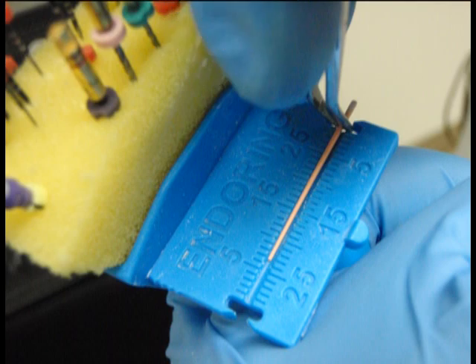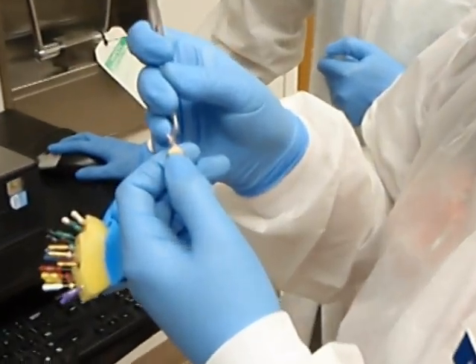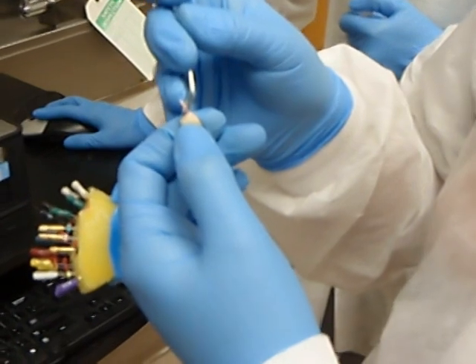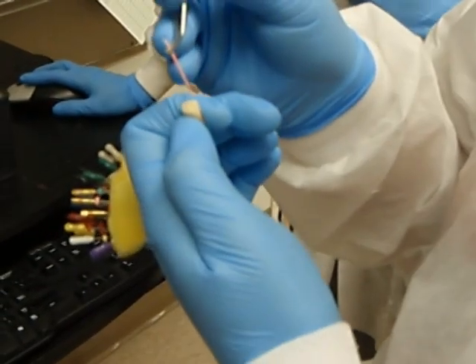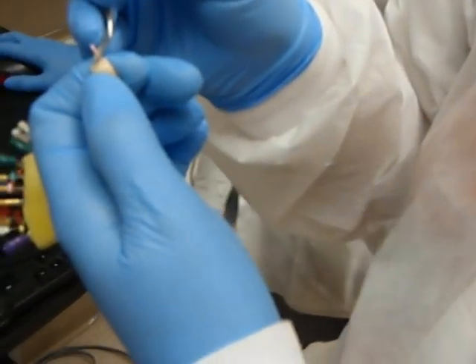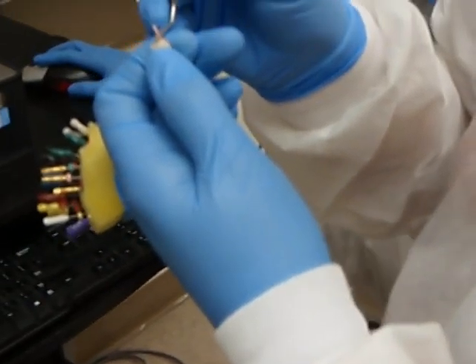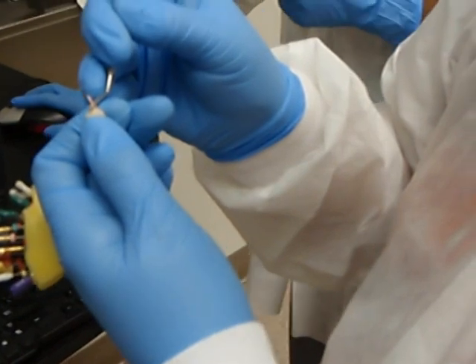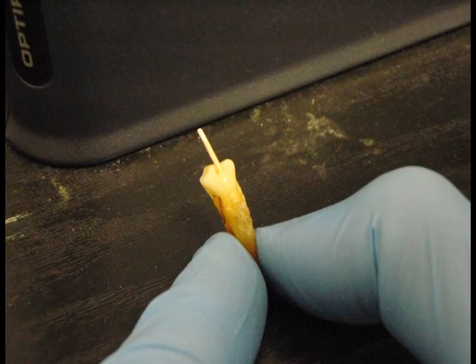Finally, a size 45 master cone is placed in the root canal along with sealer. A master cone radiograph is obtained prior to the placement of accessory cones and the final obturation, which will be illustrated in a future video.